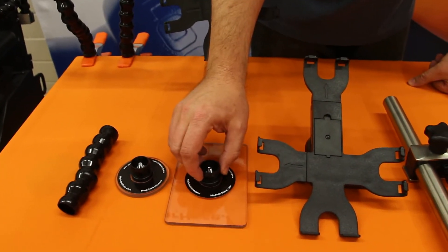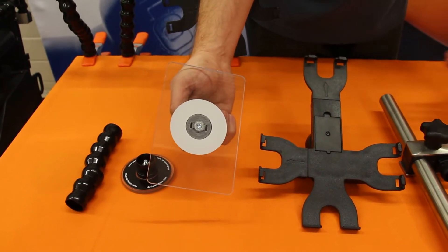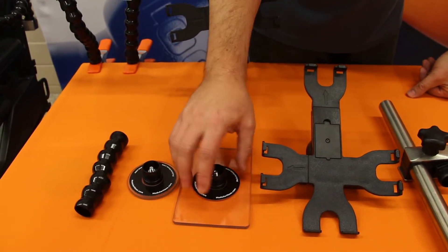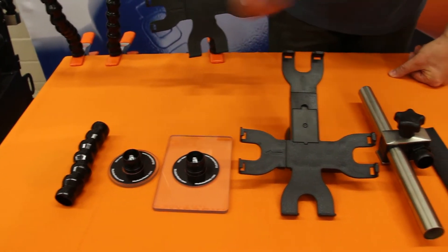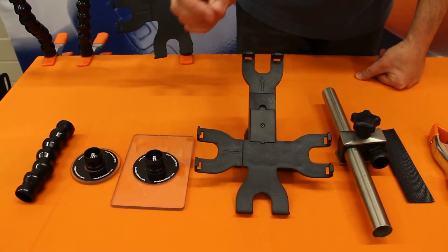Next we have the four by six plate. This plate is commonly used for lightweight devices such as a cell phone or a lightweight communication device. It can also be used in one of our kits for supporting tablet devices, which we'll cover in a later video. If you buy the four by six plate, it will come with the fixed mount piece already attached.